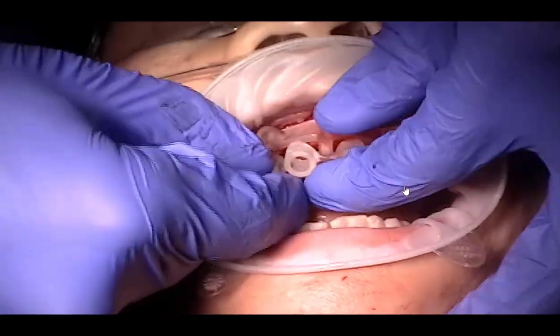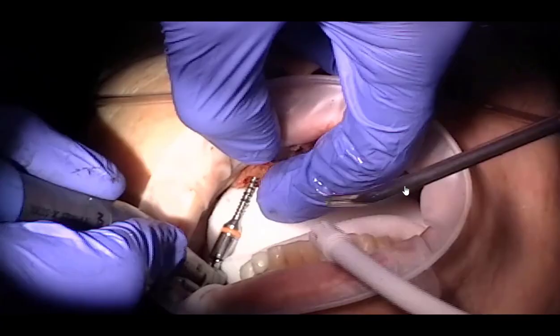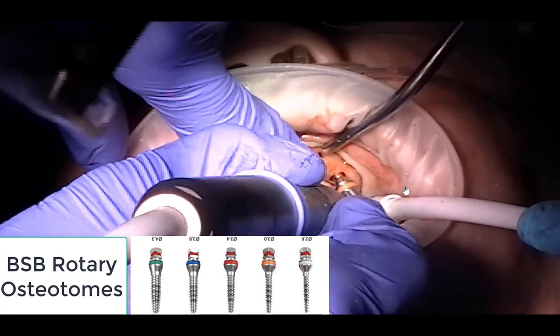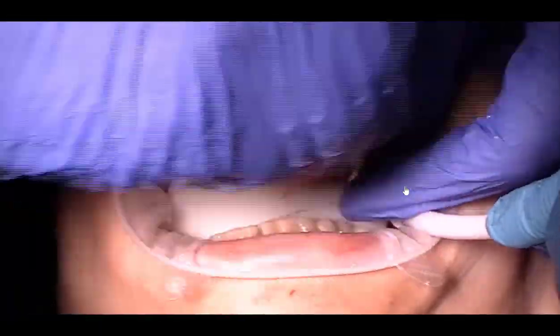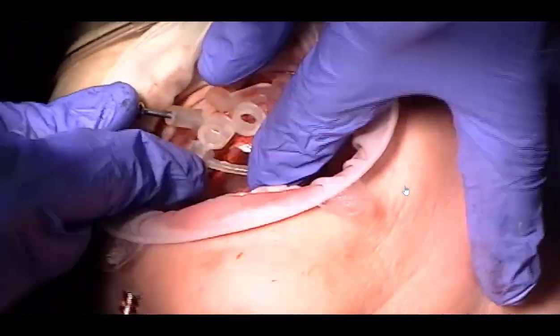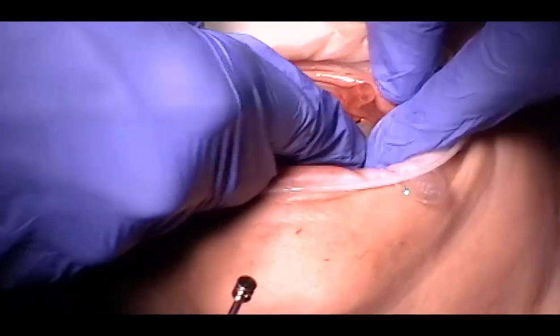He's removing the guide now, and the reason — even though we still haven't placed implants — is because we're going to immediate load this. For immediate loading, it's always a bit of a question mark whether you'll get good primary stability, so I really like to use these rotary bone expanders. Blue Sky sells a kit; numerous companies have them, but they work really well. It's the same technique as osteotomes, just driven with a ratchet or handpiece. For the 3.5mm implants where we stopped at a 2.5mm drill, we'll use a 3.0mm expander and then place the 3.5mm implants, which will do some additional expansion. The result is really high primary stability — an important factor when doing immediate load.